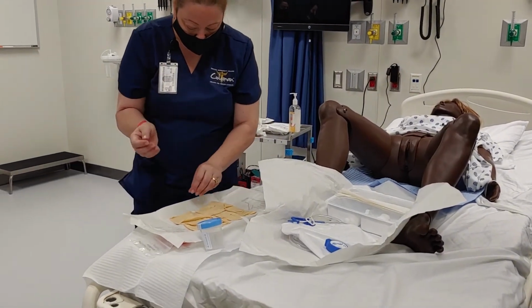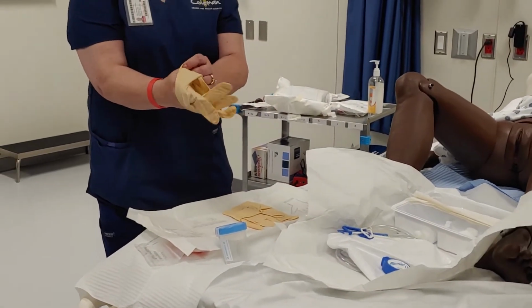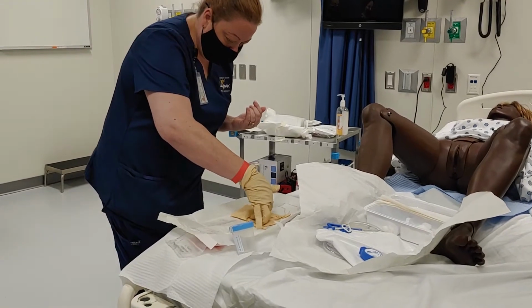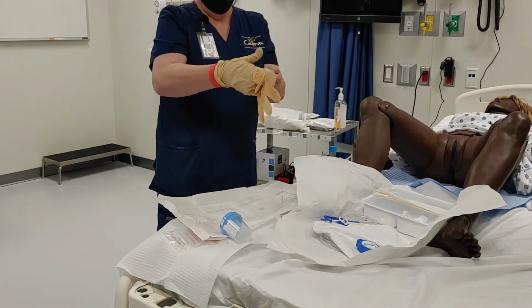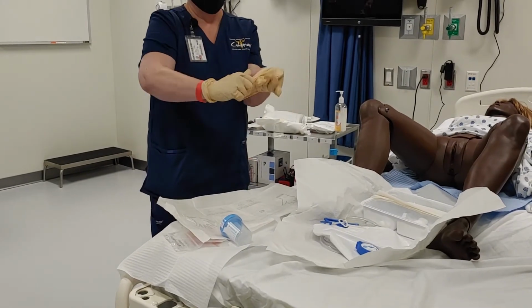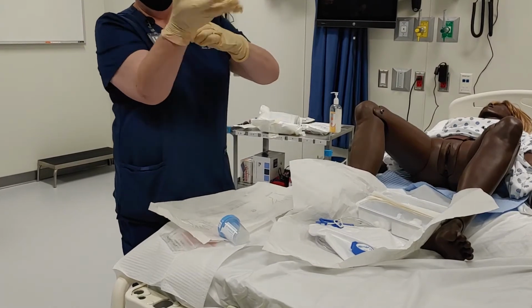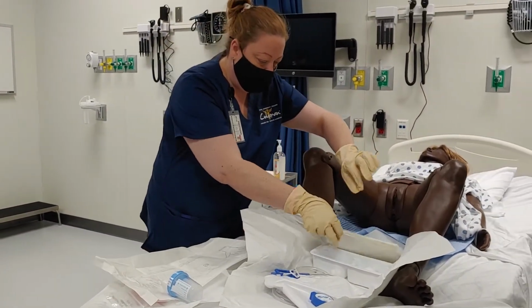Now I'm going to go ahead and put these on. Okay, now I can touch whatever I need to touch.